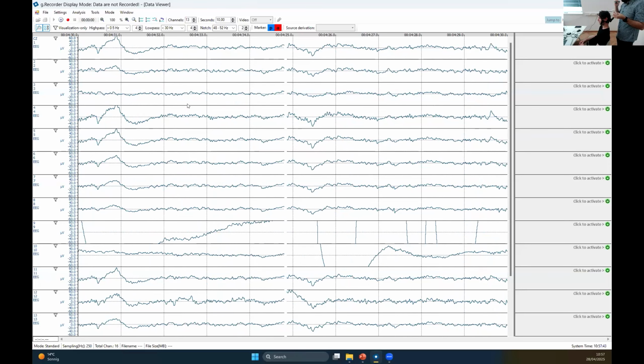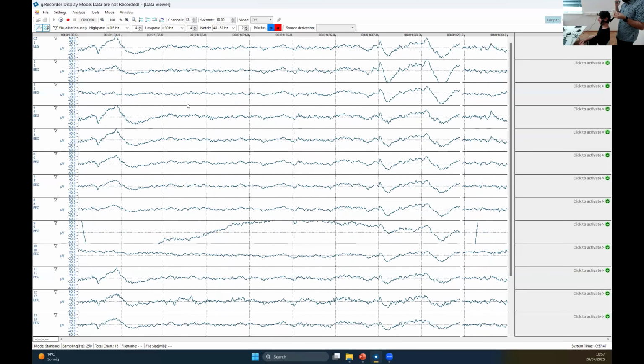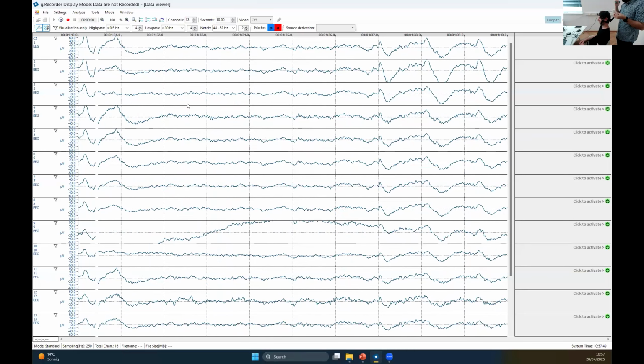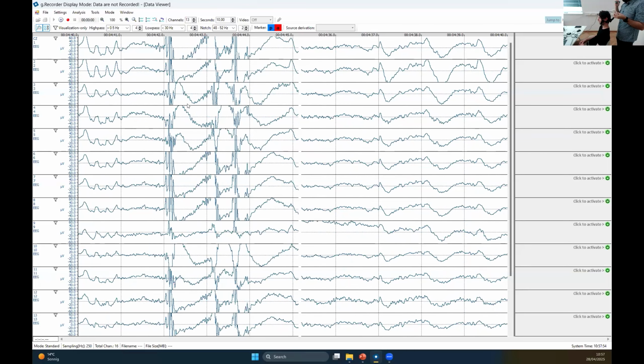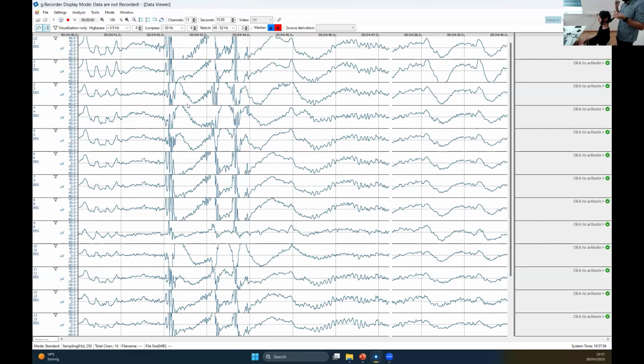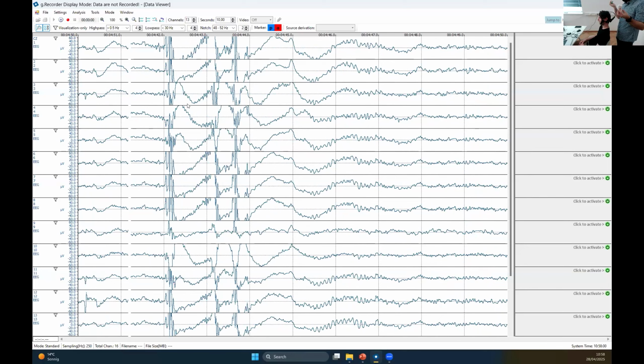Now it's good. Can you blink with your eyes, Matthias? Good. Can you bite your teeth? Good. Can you close your eyes and relax? Oh yeah, we can see some alpha activity. And you could see it's pretty easy to set up as well.